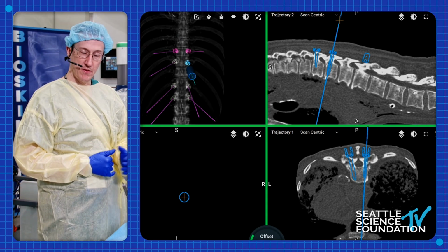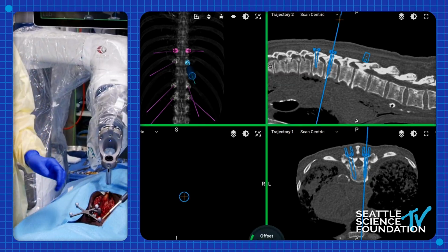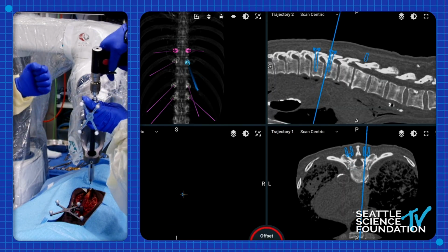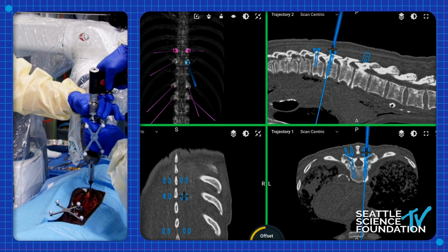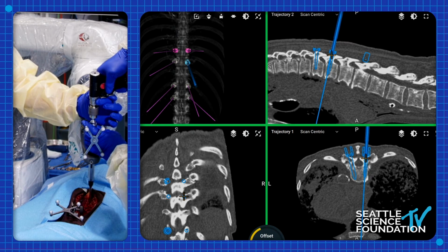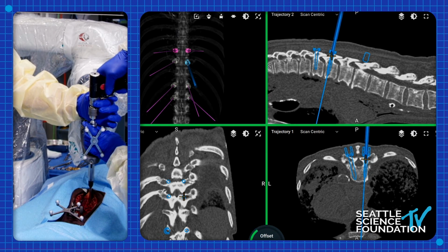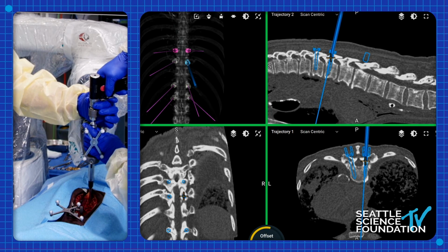When I've done this technique for burst fractures, we were able to place screws above and below and then use a device where we were actually able to use ligamentotaxis to correct some of the kyphosis that was present at the fracture. And then after 12 weeks or so, when the fracture was healed, we could lessen up on our activity restrictions for the patient.